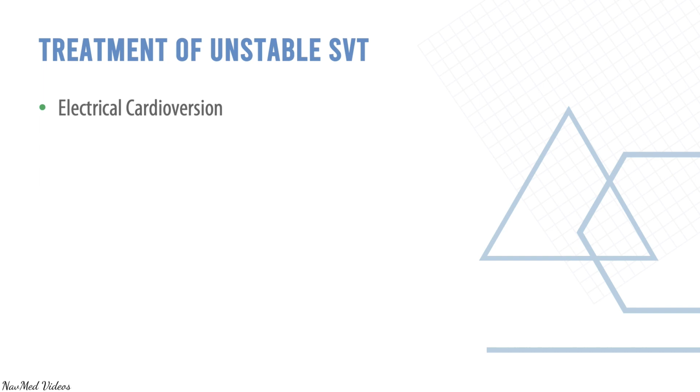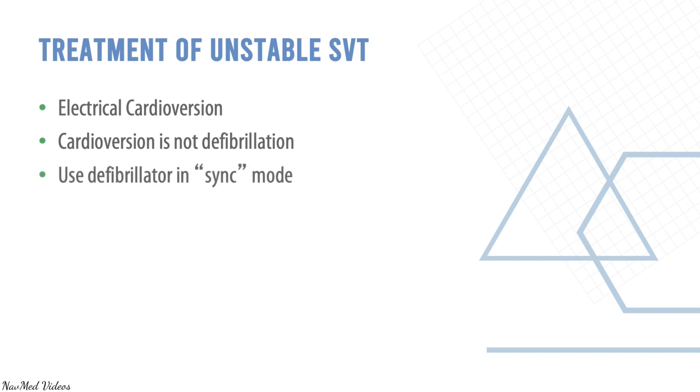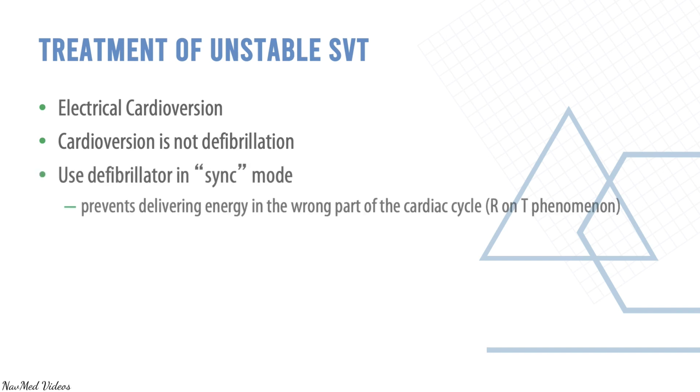Treatment of unstable is cardioversion. Remember, cardioversion is not defibrillation. You have to use the defibrillator in sync mode. It prevents delivering energy in the wrong part of the cardiac cycle.